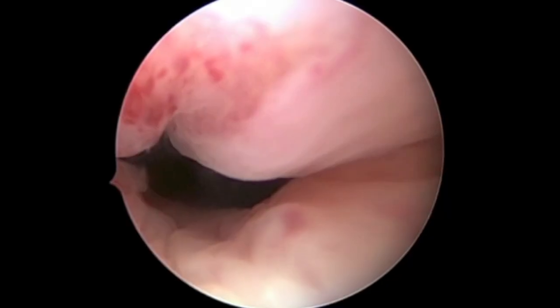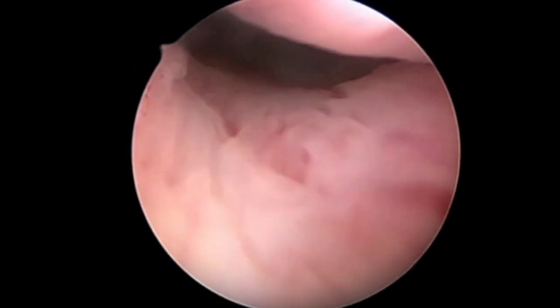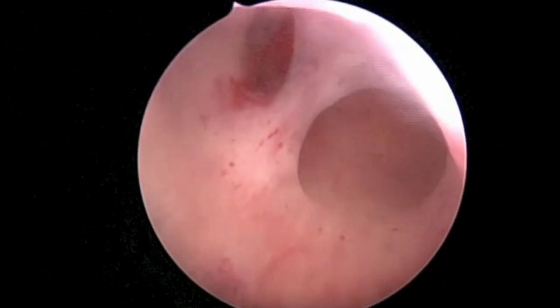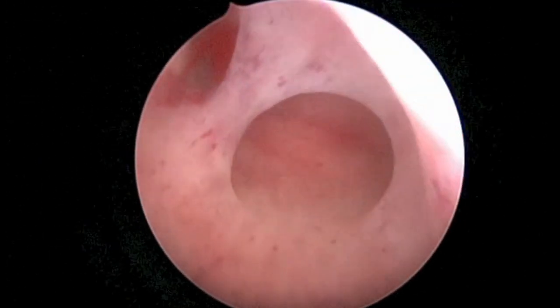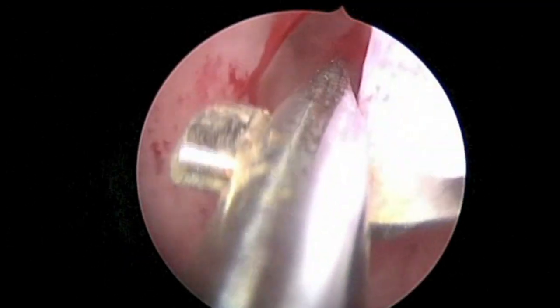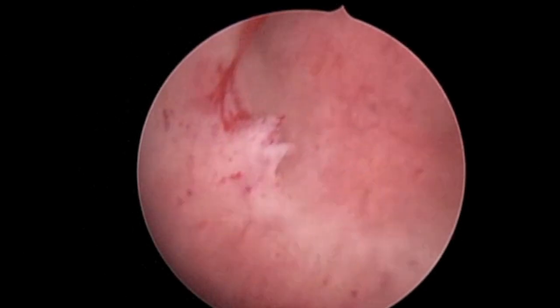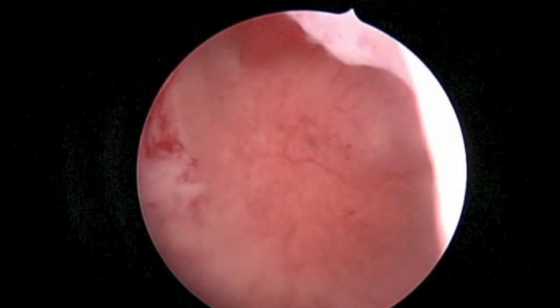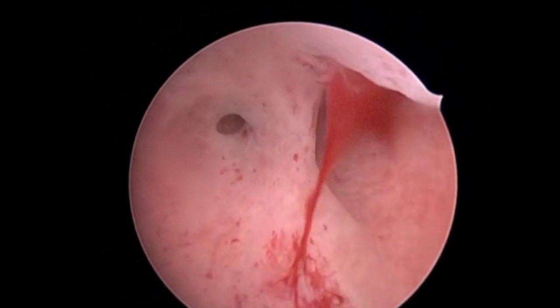The first patient is a 33-year-old female, G2A2, with a history of two dilatation and curettage procedures following first trimester losses. She presents with oligomenorrhea and difficulty conceiving. Diagnostic hysteroscopy reveals an adhesion in the mid-uterus. Micro scissors are introduced through a 5.8 mm operative hysteroscope and used to release the adhesions. Further assessment reveals some filmy adhesions near the right cornua, which are also released.